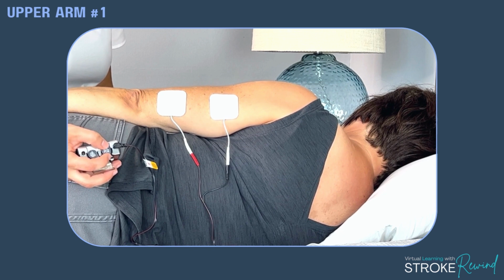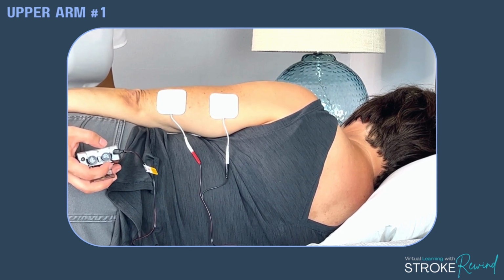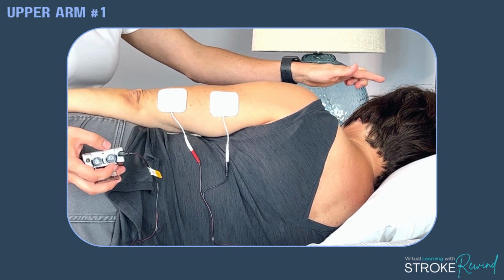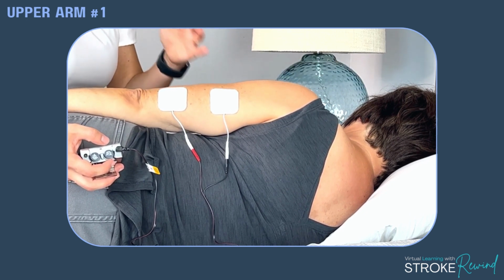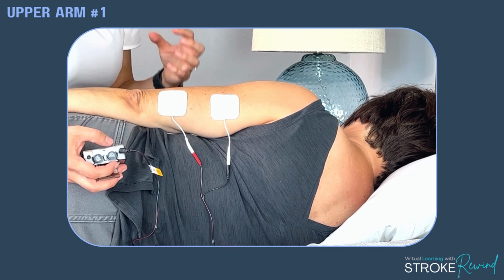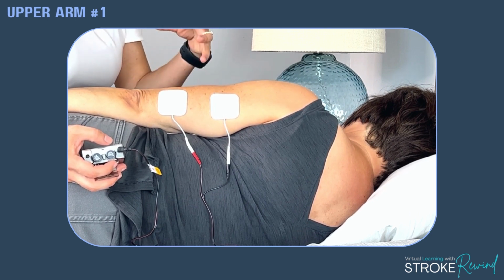We're going to see if we can get a movement. Whoop, there it is. Beautiful. Now, all this is doing is, as a movement signal is getting shot up to her brain, and then the signal is getting shot back down, and the brain is remembering, this is how my tricep is supposed to move. This is what it feels like to move my tricep. And the beautiful thing about electrical stimulation is I'm not doing it to her, so it's even more real for her brain instead of me moving it.